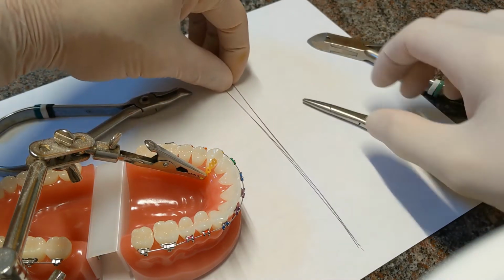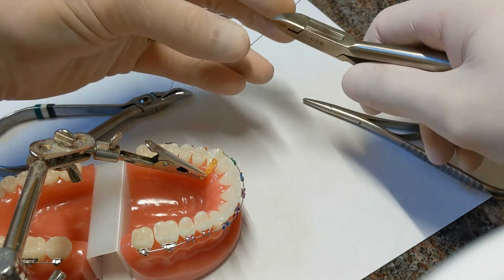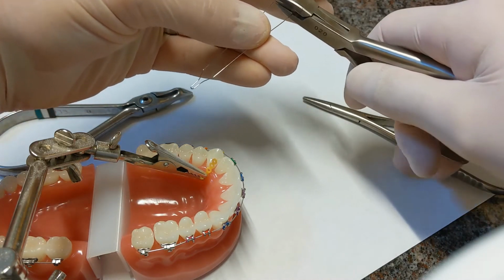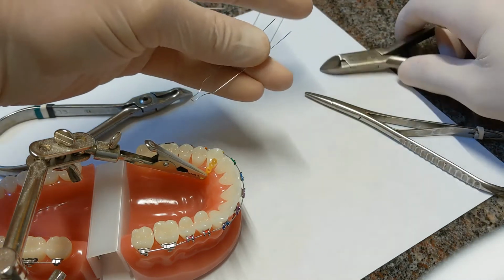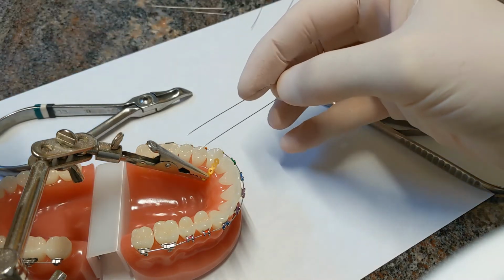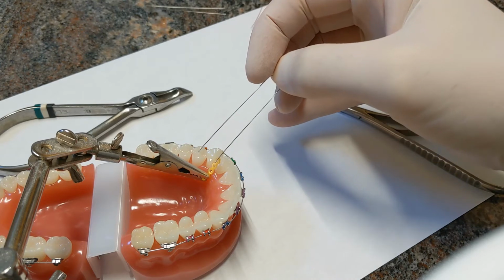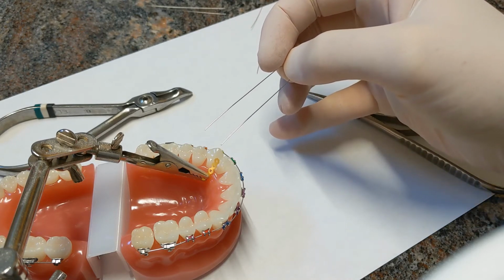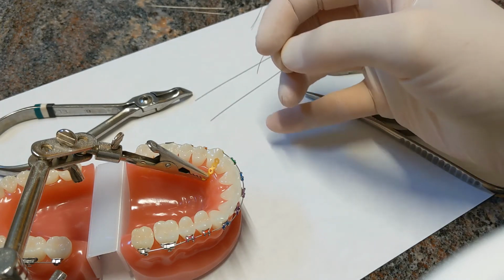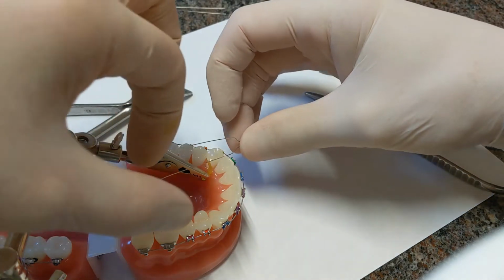So what you do is you take your 014 ligature wire. I usually like to cut off the extra here, so cut some of this off so it's not so much to work with. And then you take your ligature wire. I usually like to make the hook on about the third link of chain that is exposed out of the gums. So there could be 8 links of chain or whatever. I like to put it through the third link, and then after the hook is made, cut the rest off. So you take this, you thread it through the third link of chain like that.